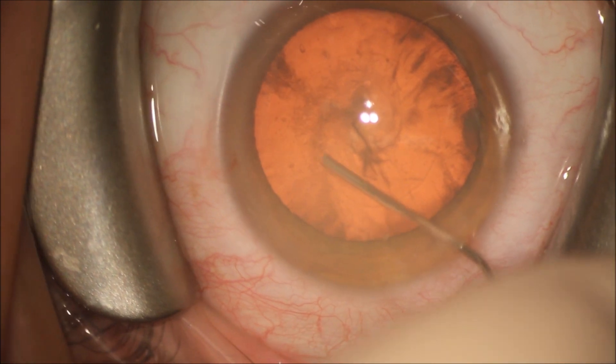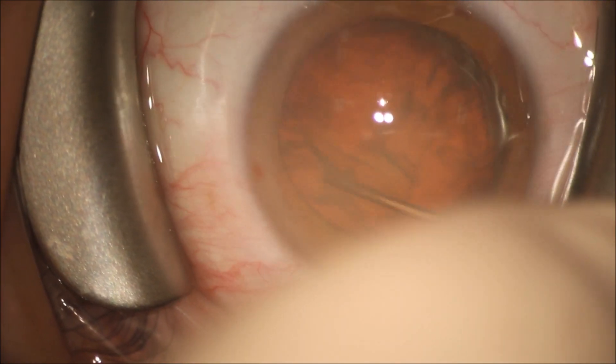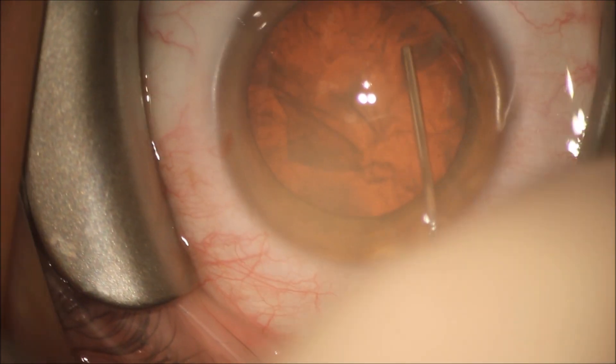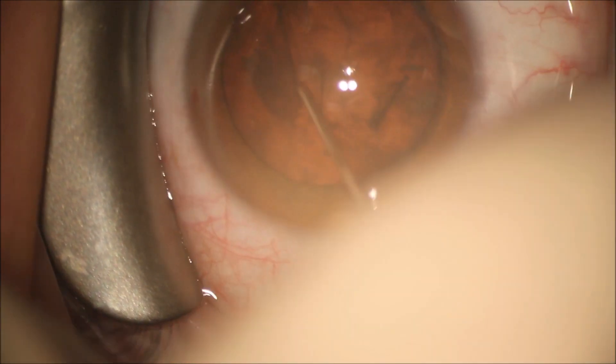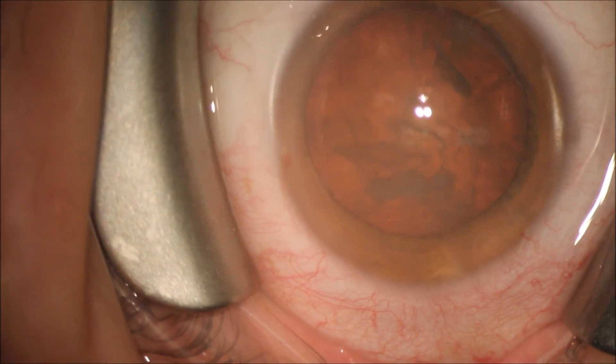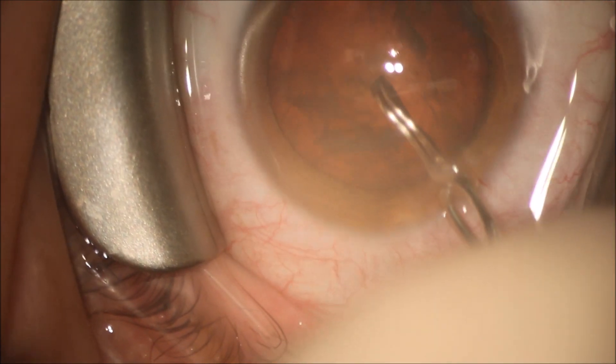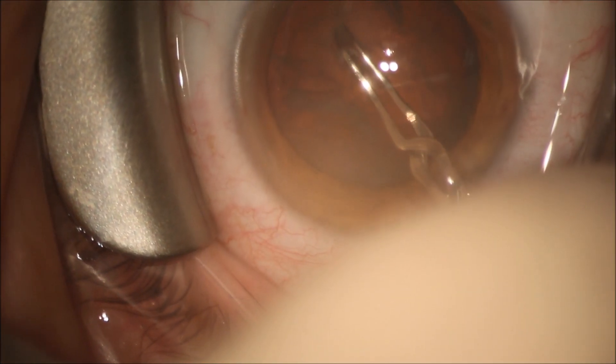We'd like to completely surround the edges of the optic, which is 6 millimeters, with the capsule to keep the lens in good position. You can see we've hydro-dissected — injected BSS behind the cataract to free it up — and we've made sure the capsular connections to the lens are broken.